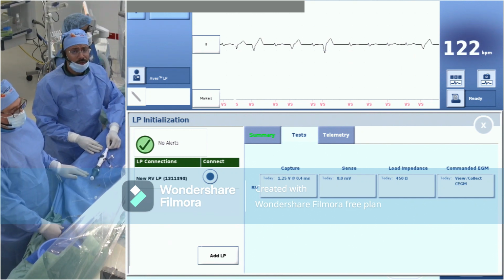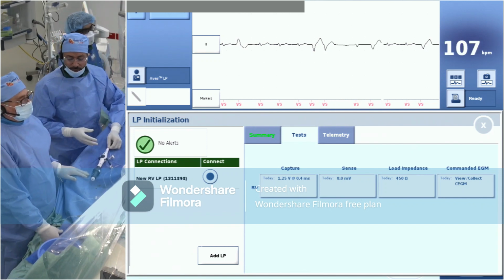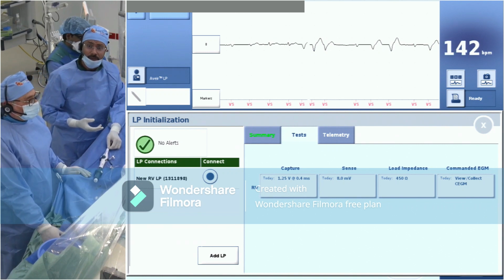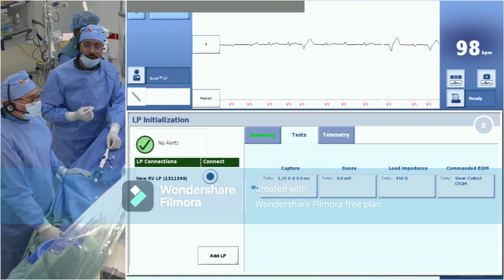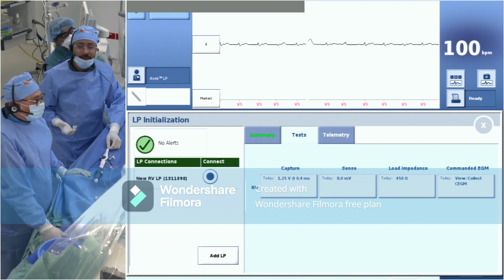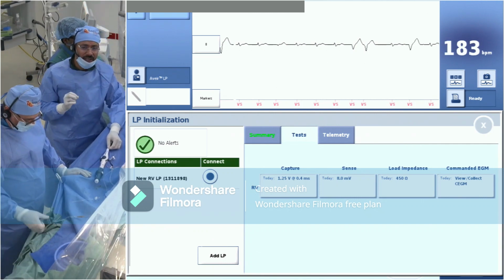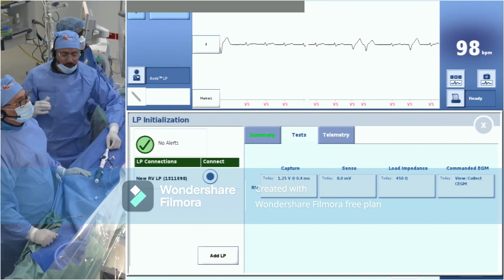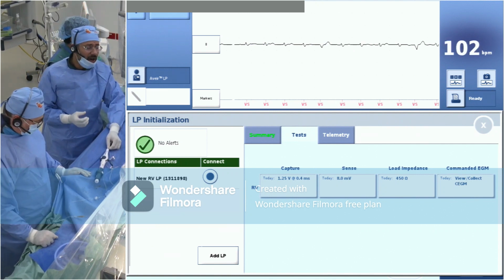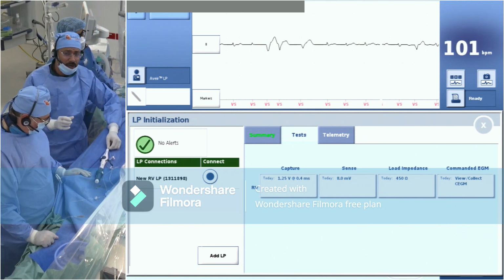Thank you so much for such a wonderful question, especially when we are using this technology. Simply, if this happened after 1 year, I will upgrade it to dual chamber. I will bring another AVEIR and put it in the atrium. This is what's nice about the technology, that you can upgrade it. If you're following up the patient, and keep in mind, we are very meticulous when it comes to leadless technology. I think you heard our colleague Dr. Michael, we're approaching almost 190 leadless pacemakers. Our mean age is 74.5. This is the age that we are implanting.